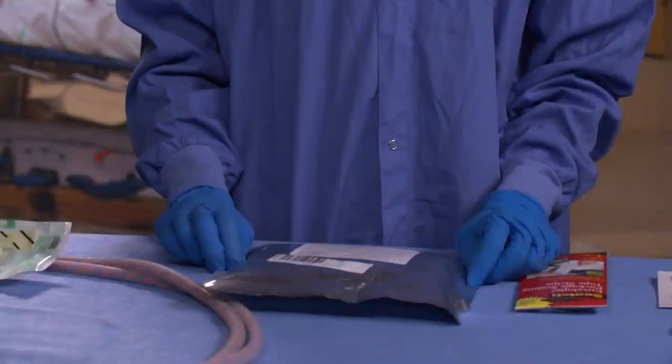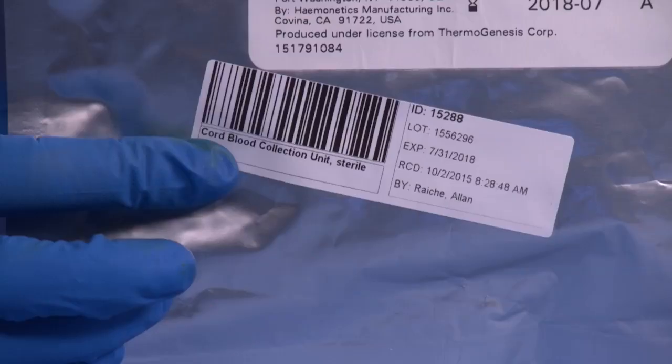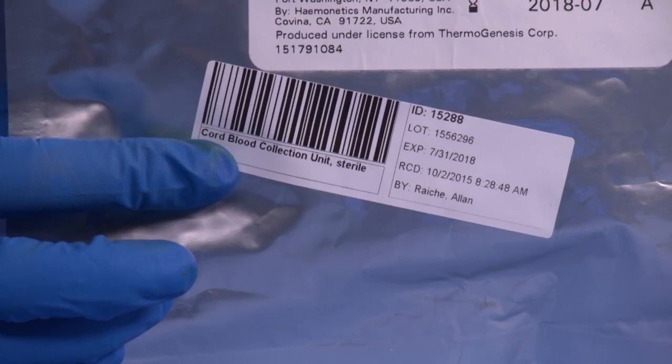When checking the actual collection bag, you will need to check under sterile conditions if you are in the operating room. The date should be located on the outside of the bag. If the bag is outdated or damaged, discard the bag.